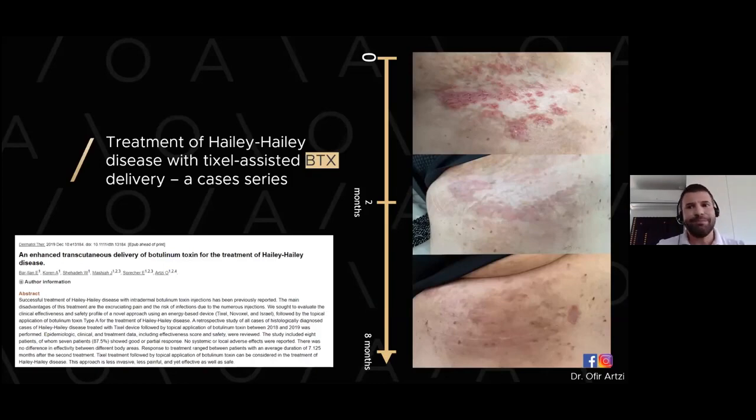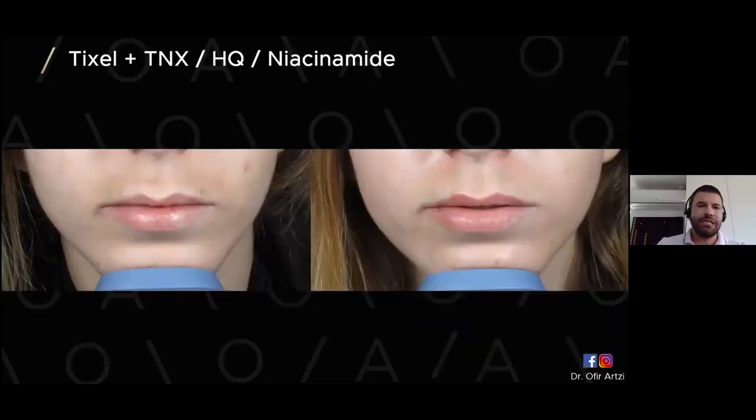First Tixel, second application of botulinum toxin, two treatments, the same regimen as we performed with our rosacea patients, and very nice results. I didn't include it in this webinar, but in the study in the reference, you can even see the histology.